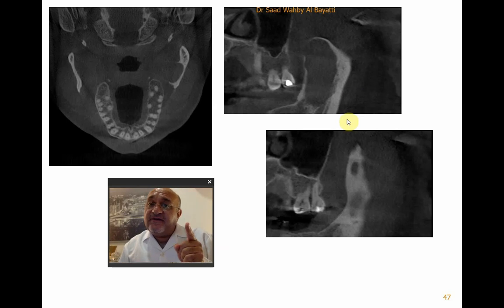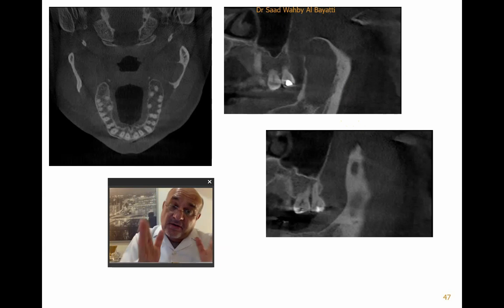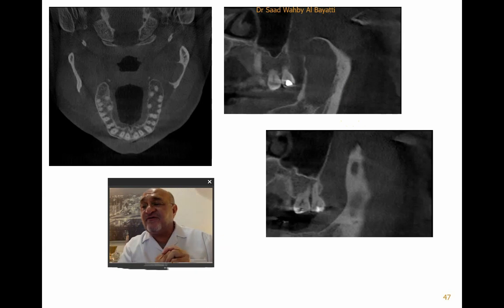The good thing here is that if you take the same patient in a CAT scanner, the slice thickness is more, so you cannot exactly locate the start or the end of the lesion, comparatively with the cone beam, because it might fall within this 3 millimeter thickness.